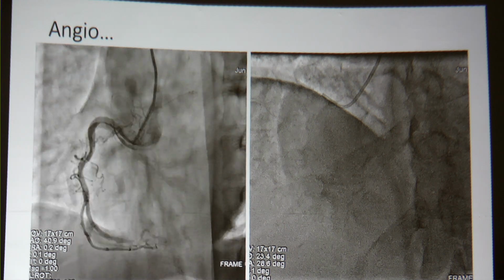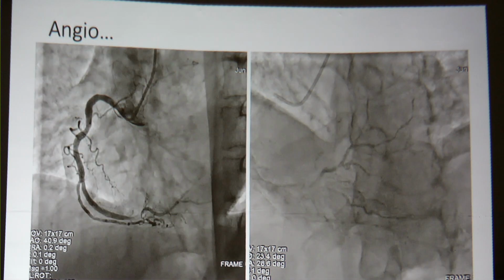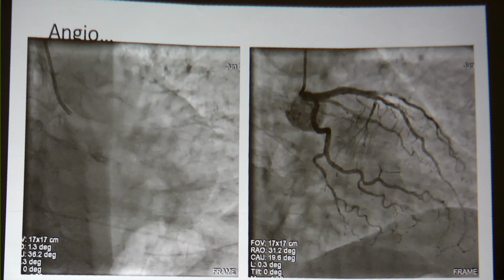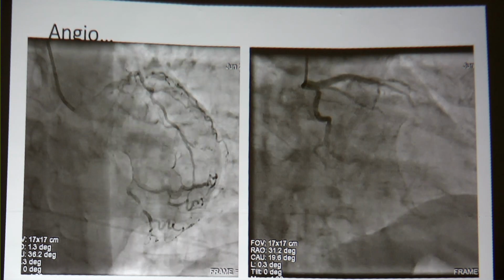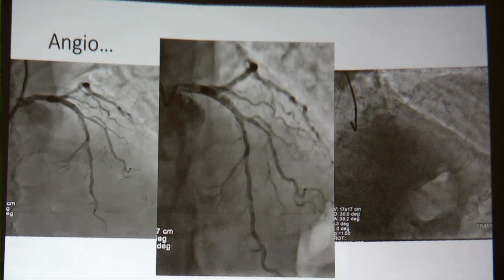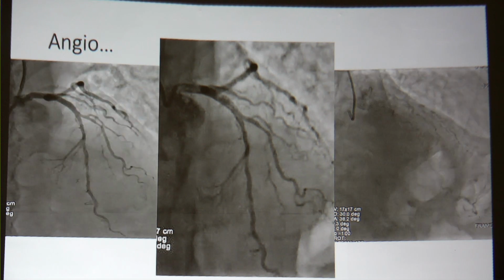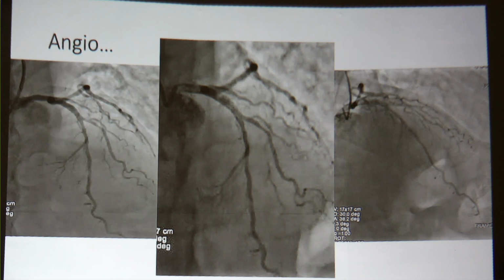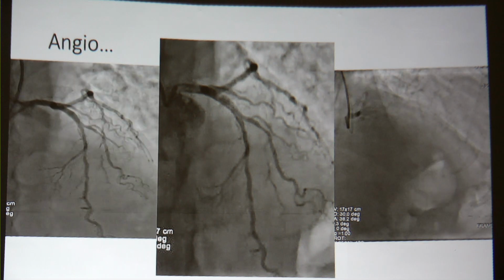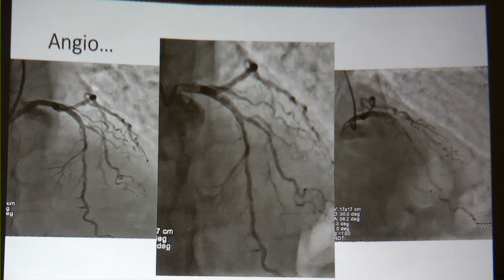Two controversial cases I would like to discuss with you here. This patient had an inferior wall MI, probably non-ST elevation MI, for which he was stented in the RCA. So now he has a lesion like this. See, we have been concentrating on the culprit vessel all this time. Now you look at a lesion which is in a non-culprit vessel. In an inferior ACS, an LAD lesion looks like this. So most of us, what will you do there? Probably seniors will say I will just leave this for medical management. Or other trials say that I will do a physiology there, a non-culprit physiology, and assess.